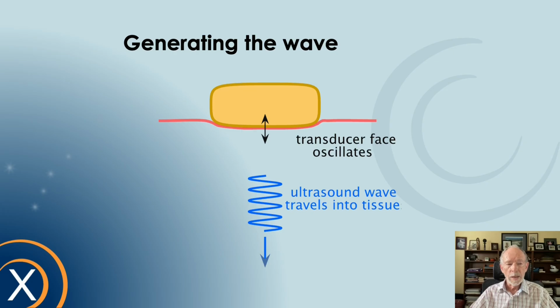As you probably understand, ultrasound imaging is based on the idea that you transmit a short pulse of ultrasound into the patient's tissues, and then that ultrasound interacts with the various structures within the tissues, creating echoes. Echo energy travels back to the probe, it's detected by the transducer, and converted into electrical signals which are processed by the machine and displayed.